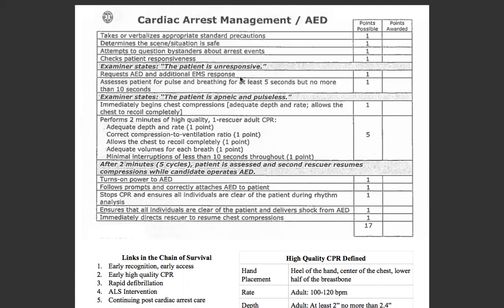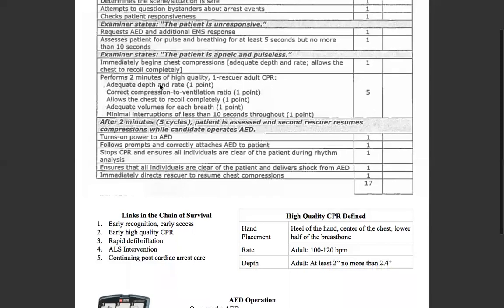Then we will assess for a pulse and breathing — at least five, no longer than 10 seconds. Remember, that's a carotid pulse; make sure your fingers are in the appropriate location when you're checking that. Then you'll find that the patient is apneic and pulseless. You immediately begin chest compressions at the appropriate depth and rate, allowing the chest to recoil completely — that's very important.